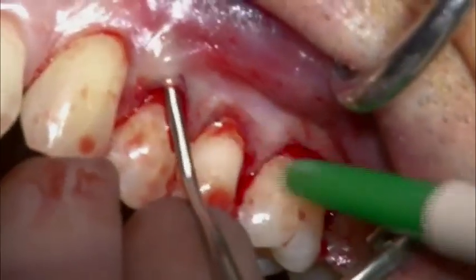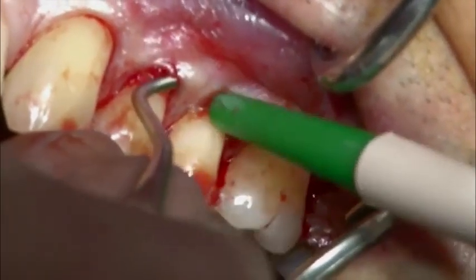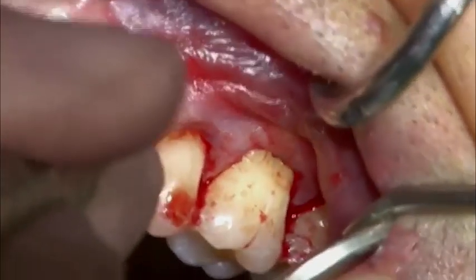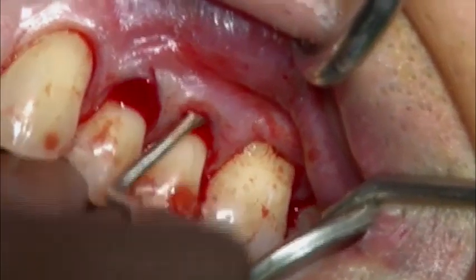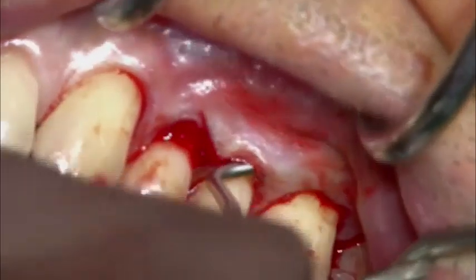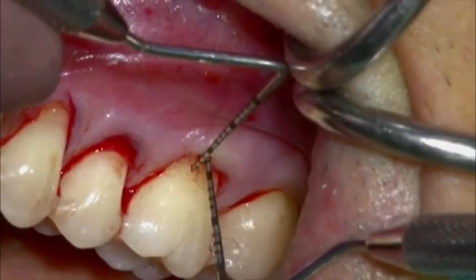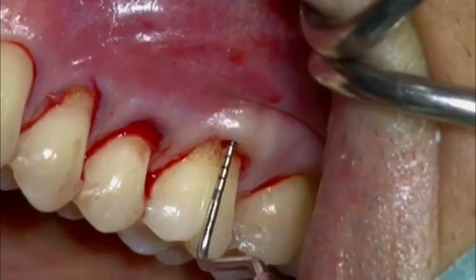A curved tunneling knife is used to finalize the tunnel preparation. Care must be taken in order to create a deep pouch beyond the mucogingival junction while keeping the tip of the interproximal papilla attached to the teeth below the proximal contact point. The depth of the pouch is measured with the help of periodontal probes and the presence of a bony balcony can be assessed.